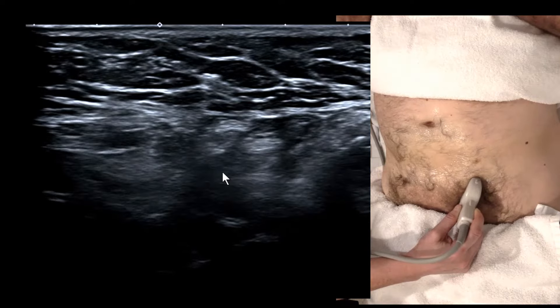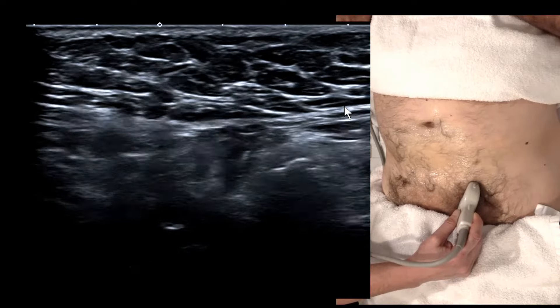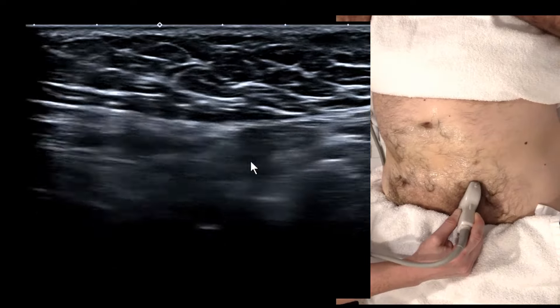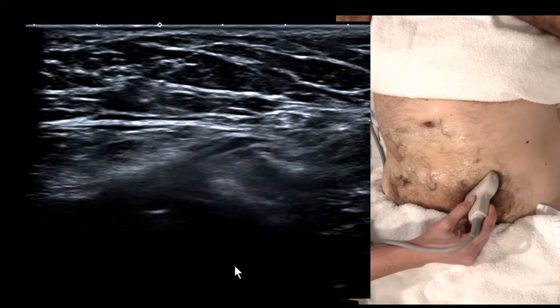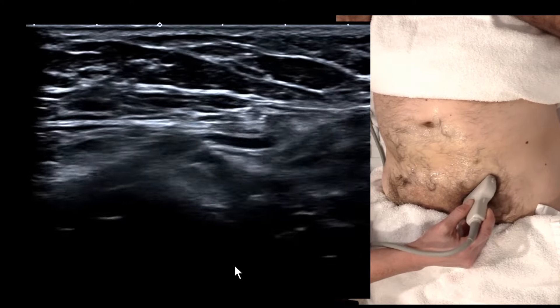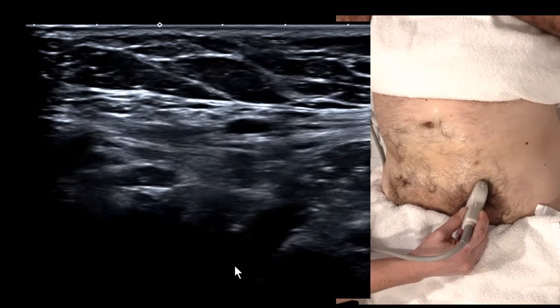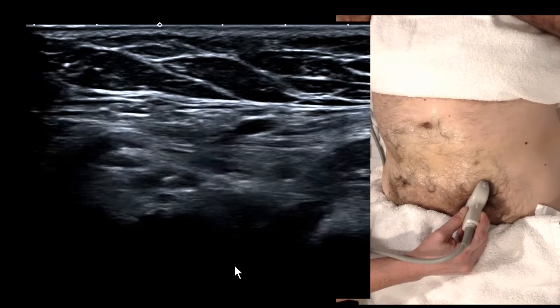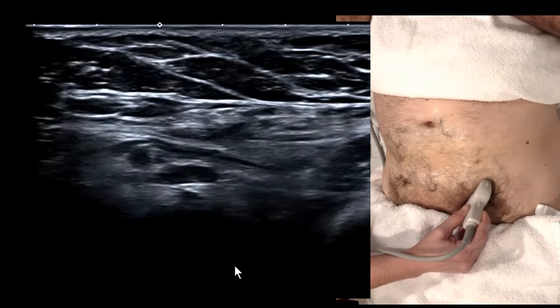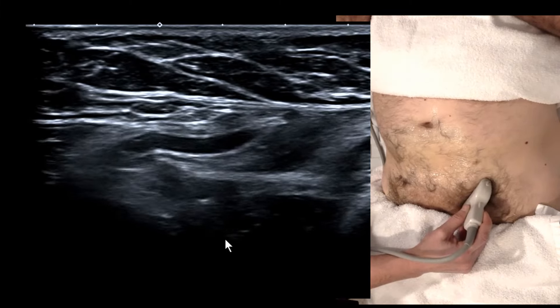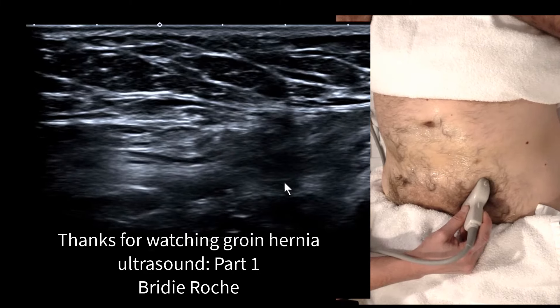Watch the fat — it's dark grey and doesn't have any black stripes in it; there are no veins in a hernia. That's a completely normal deep ring. There's a big defect in the posterior wall of the canal — not too laterally — and immediately above the pubic tubercle there's no white line: this is a direct hernia, passing out the superficial ring but not entering via the deep ring. What's of interest to the surgeon is the contents, whether it reduces, the size of the defect, and whether there's a concurrent hernia through both the deep ring and the posterior wall.